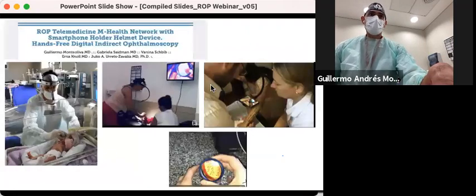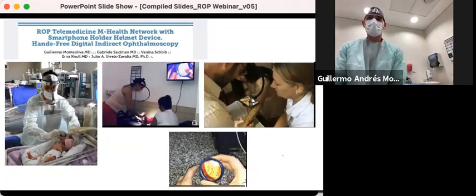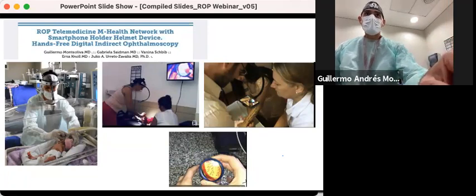At APOS, we showed the potential benefits of building smartphone telemedicine networks in Argentina, teaching in steps, first with a simulation eye, then practice in the office, first with bigger babies, and finally with smaller premature babies at the NICU and follow-up office. Next slide, please.